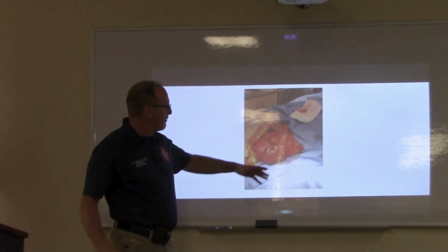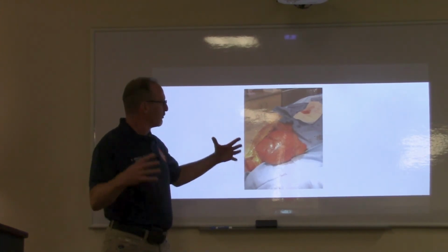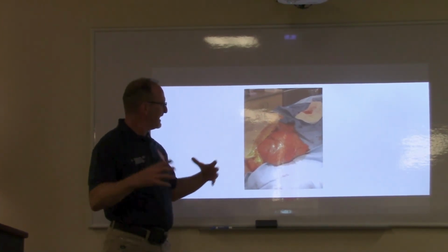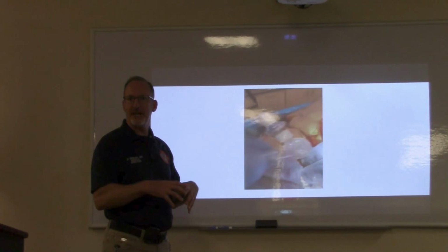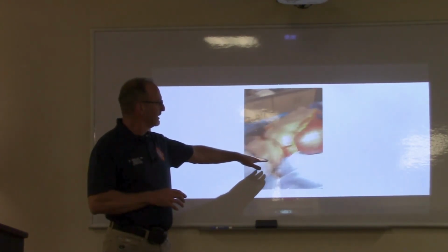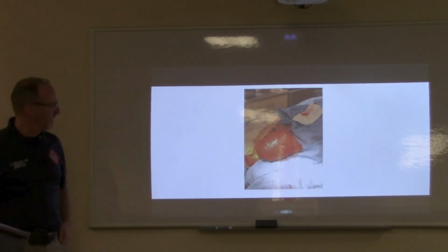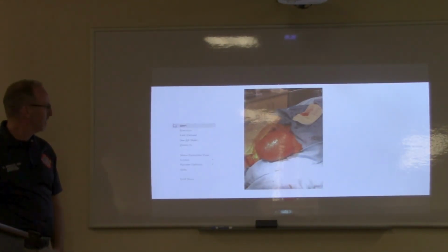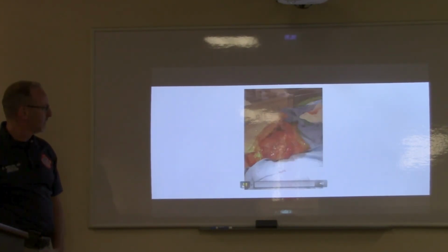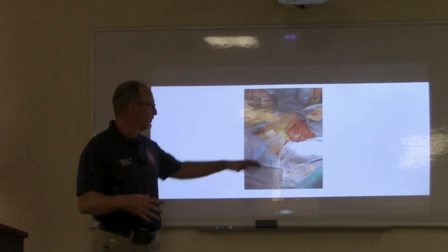So you'll see how much more open the lung stays with each breath, okay? So we're recruiting alveoli, because when we exhale, it's not just shrinking back down, okay? So we're just holding, releasing. Look at how different the lung looks. Okay, so that lung is kind of deflated, no PEEP.